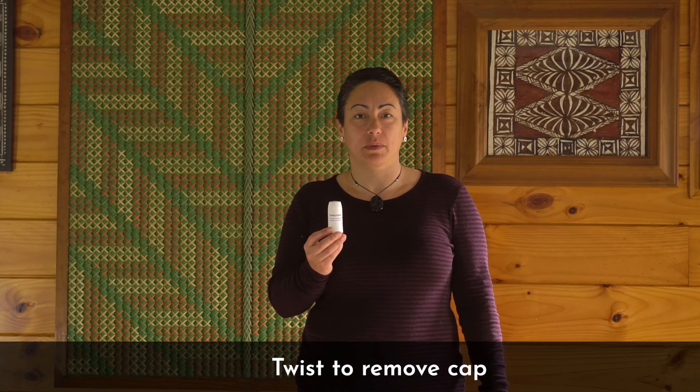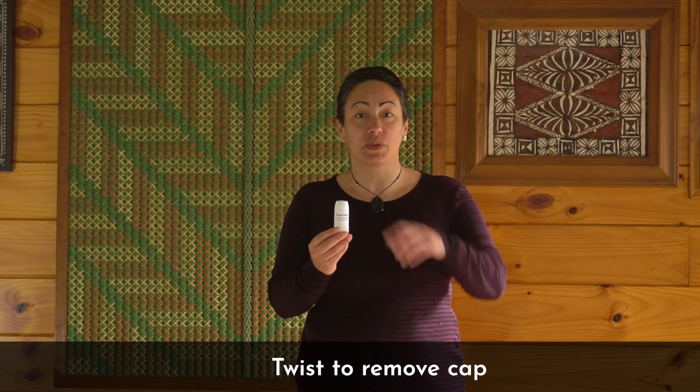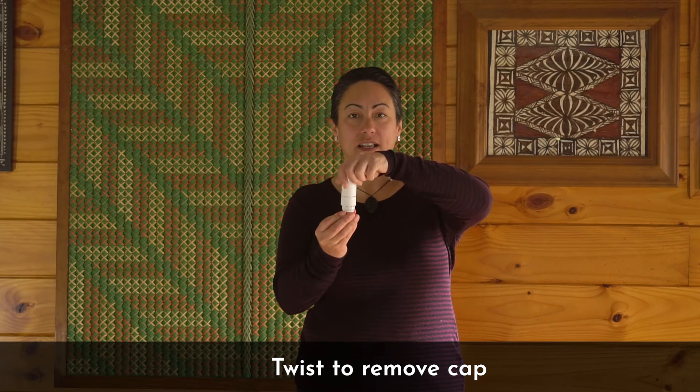First, you'll need to remove the cap. Do this by twisting the cap until it comes off.